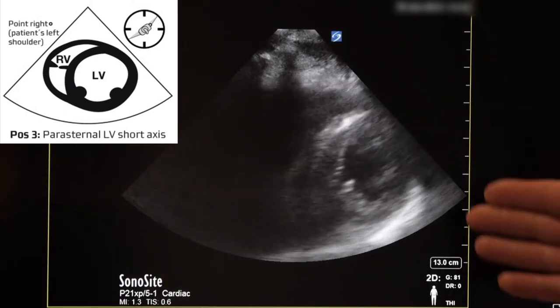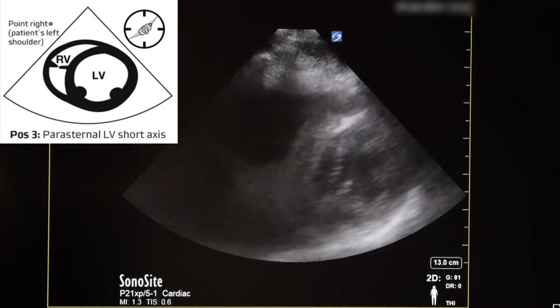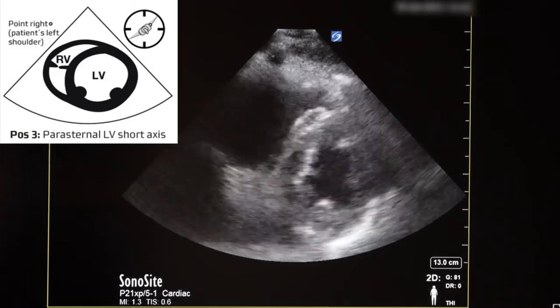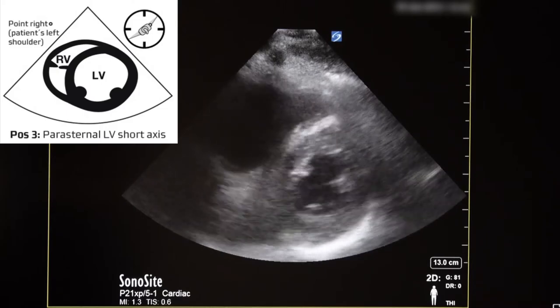If we find we're at too apical a view, we tilt the probe down towards the patient's left hip. The optimal parasternal short axis view shows a cross-sectional view of the left ventricle at the level of the papillary muscles, with the right ventricle sometimes visible. This view is great for evaluating overall cardiac function, looking for wall motion abnormalities in the left ventricle, and signs of right ventricular strain such as in pulmonary embolism. We can also quickly assess volume status — low volume produces the kissing papillary sign, where the two papillary muscles come together due to decreased volume.